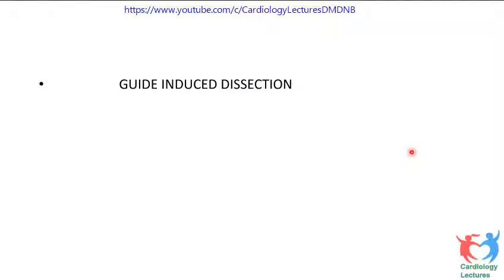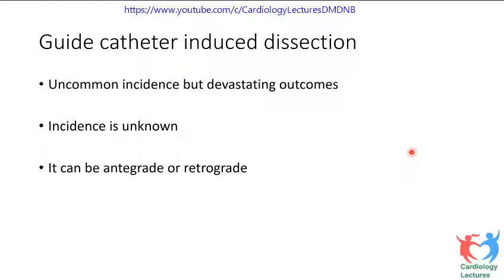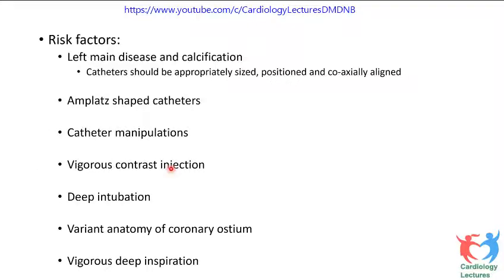Another important thing, the next part of dissection, is guide-induced dissection. It's very uncommon, but it can be devastating. Incidence is unknown, and it can be an antegrade dissection or a retrograde dissection. Predominant risk factors for guide-induced dissections are left main disease and calcification.